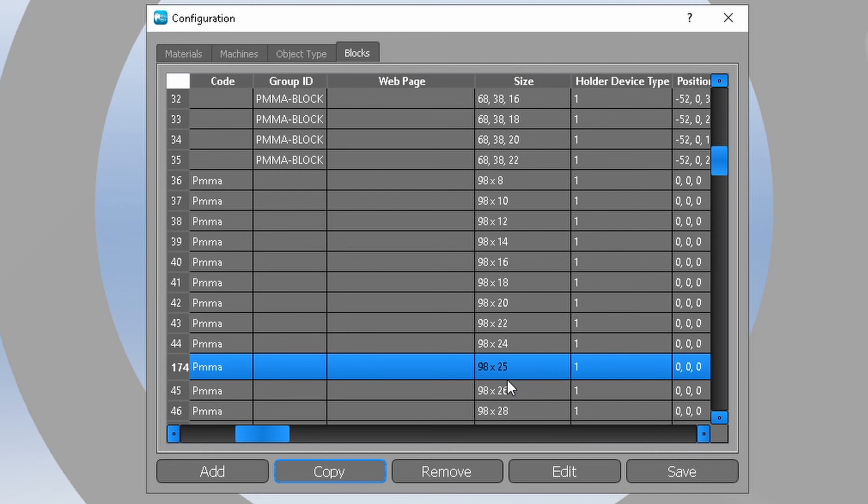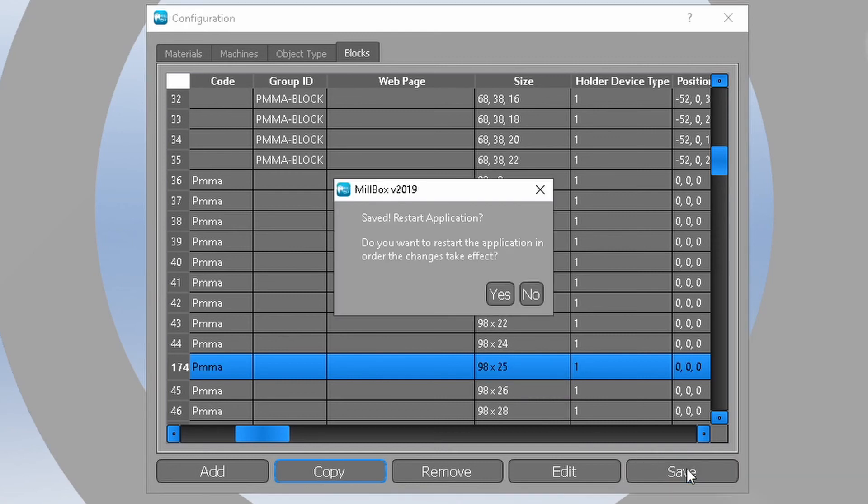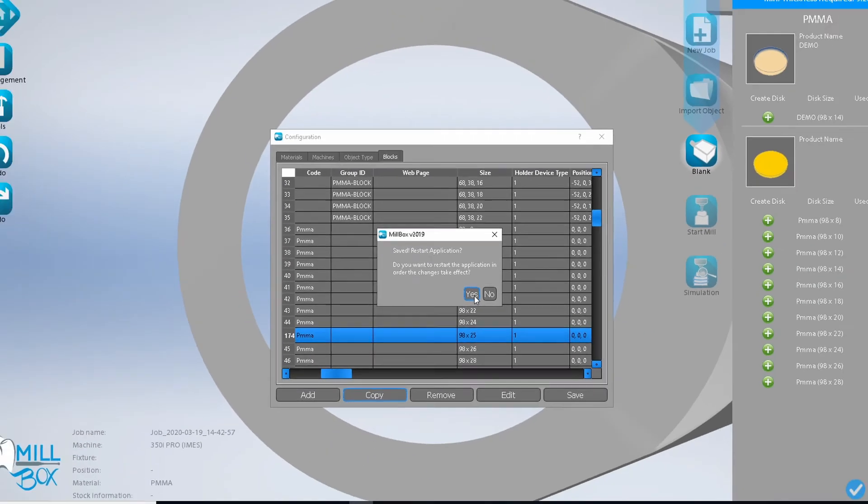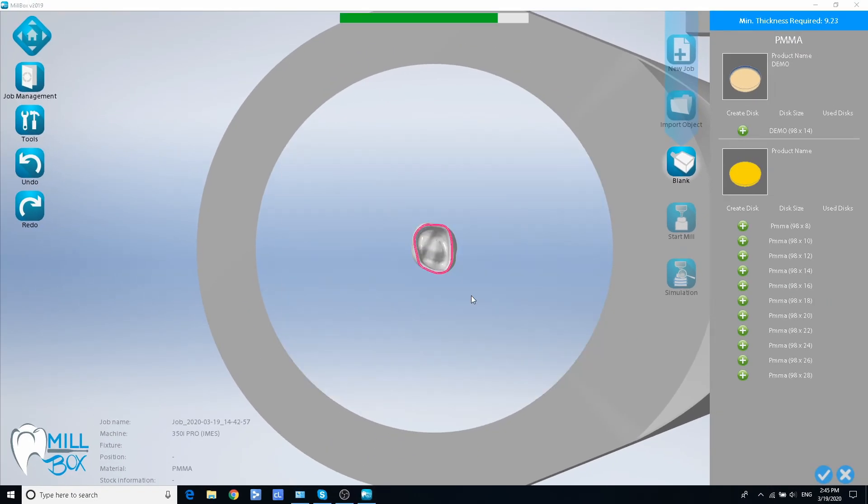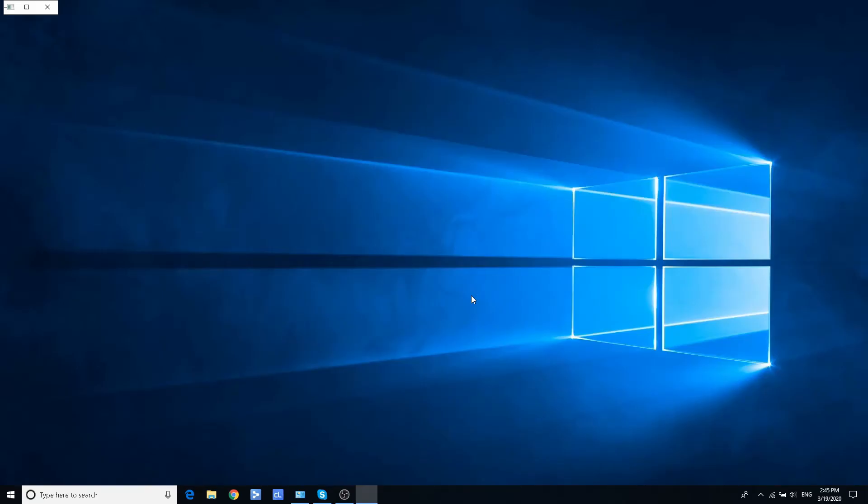Click save button. Millbox will ask you to restart the application. Click yes button.